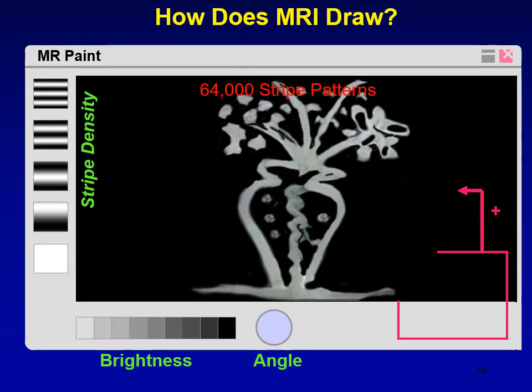One point I would like to make at this time is that the order in which the data is added to the image really doesn't matter. The important thing is that there be enough data of different frequencies, intensities, and angles to be able to reconstruct the image at the spatial resolution that is desired. The order itself doesn't matter.